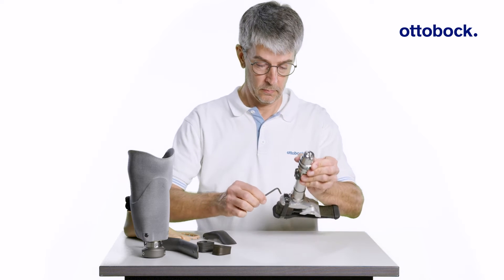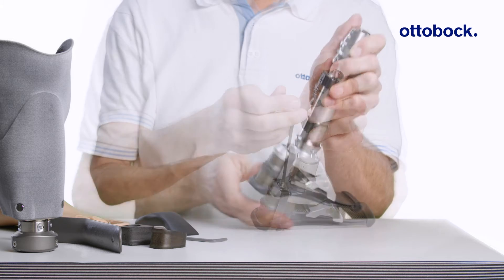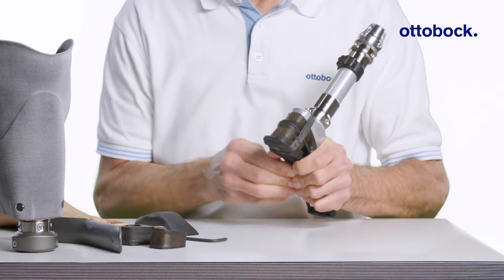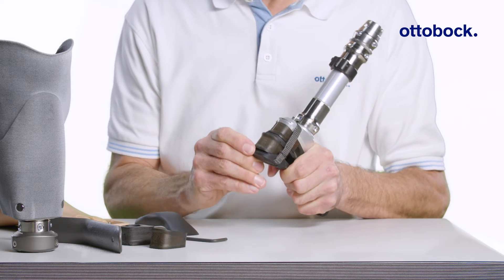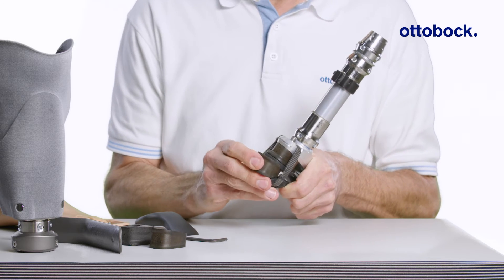Loosen the allen screw on the top with a 4 mm wrench until fully open, then push the lower wedge out. Sometimes it helps to push up on the nylon bottom plate, as this will help release tension on the wedges.